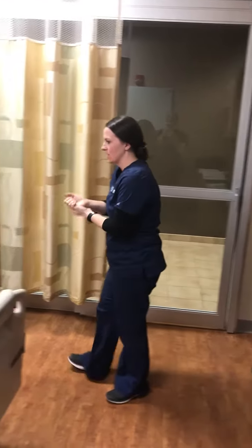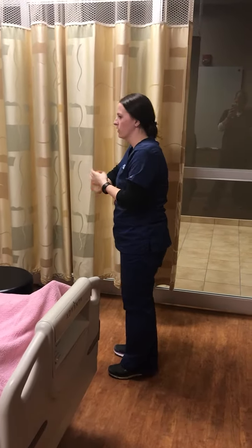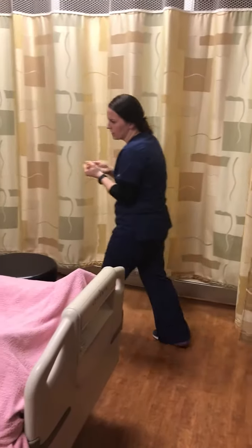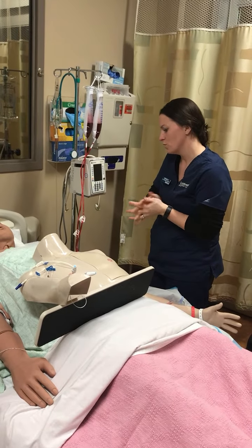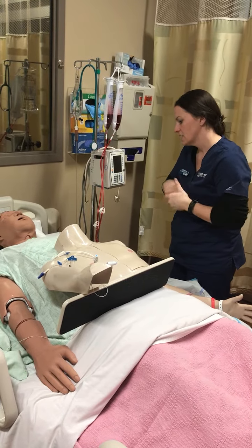My name is Tiffany, and I am one of the student nurses here that is going to be working with you today. I just want to check, it looks like we have a need for some Zofran medication that will help with your nausea. Is that correct?